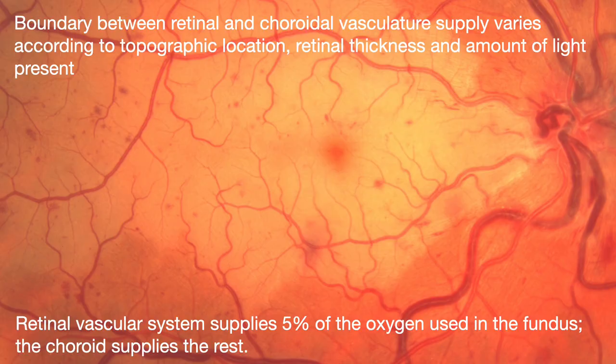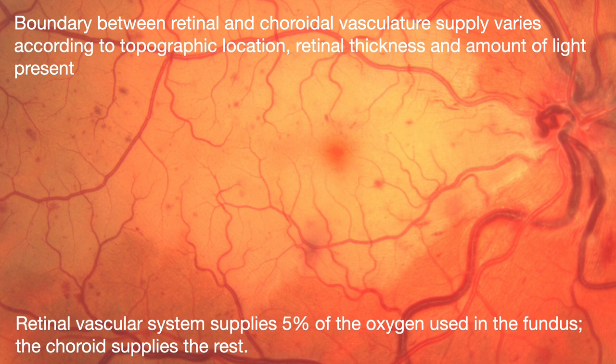So we can see blood vessels in the retina. Does anybody know what this diagnosis is, by the way? So in the center we've got an occlusion of a retinal artery — maybe a cilioretinal artery — and there's also a lot of venous tortuosity. It's a complex picture. I think it's a cilioretinal artery occlusion with a CRVO as well. Unusual scenario, but it's out there. The boundary between the retinal and choroidal vasculature supply does vary.